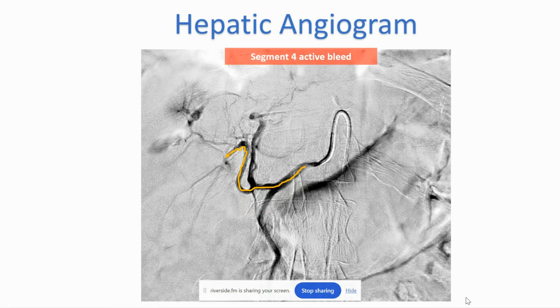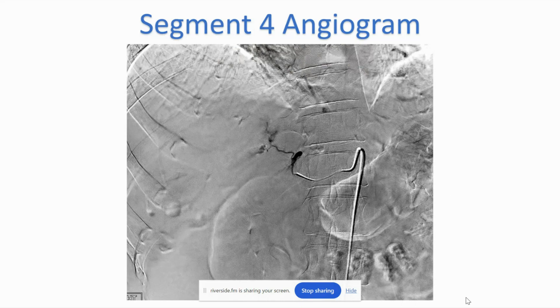So our goal here is to follow this orange line and get into the Segment 4 hepatic artery. As you can see, my base catheter here is a VS1, or a SOS catheter, a reverse curve catheter. And we're going to use our microcatheter now to selectively catheterize that artery. And now we're in the Segment 4 hepatic artery.